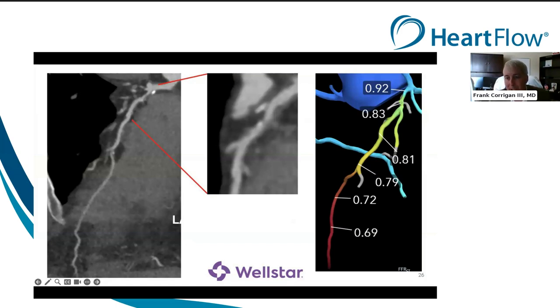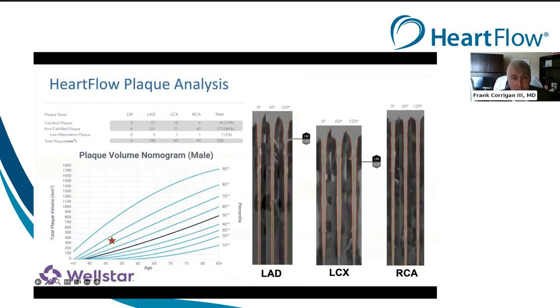Looking at the hemodynamic significance, there's a slow decline in FFR value that we often see in patients with diffuse mild-to-moderate disease. If this patient were in the cath lab, you probably wouldn't use invasive FFR because there's not a discrete focal lesion — that's the type of disease we see on coronary CT. People sometimes ask if the FFRCT is wrong — I don't think it's wrong, it's just not a focal lesion, so there's not a discrete delta, although there is a change in flow throughout the vessel. The main thing is: there is a lot of plaque, and we did this to further understand his risk.